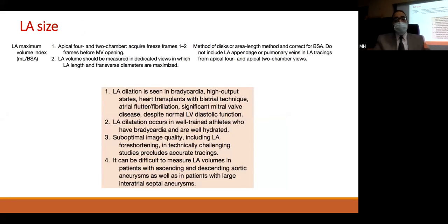Left atrium size: you know that all our echocardiographic reports rely on the anteroposterior diameter, but sometimes the left atrium is dilated in other directions. So the guidelines recommend the use of the left atrial volume index, if it's more than 35. So this also supports the presence of diastolic dysfunction.